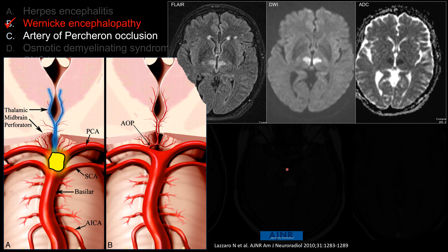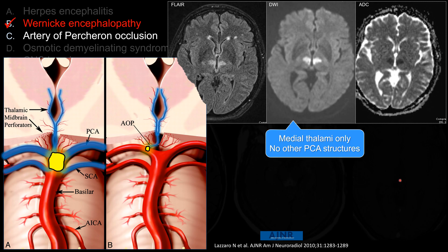However, if you see that, usually you will affect more than just the medial thalami, including infarction involving other structures in the PCA territory and potentially in the superior cerebellar artery territory. If you have an artery of Percheron variant, a thrombosis can be quite small, causing obstruction at the origin of the common trunk, causing selective infarction of the medial thalami without affecting other areas in the PCA territory. That is artery of Percheron infarction involving the medial thalami bilaterally only, without affecting other PCA structures.